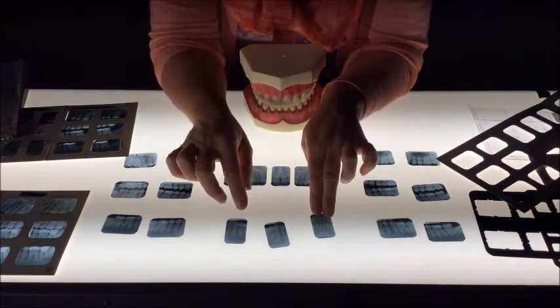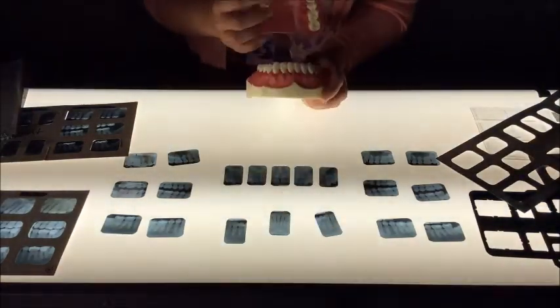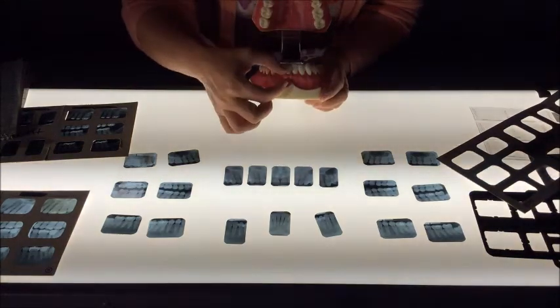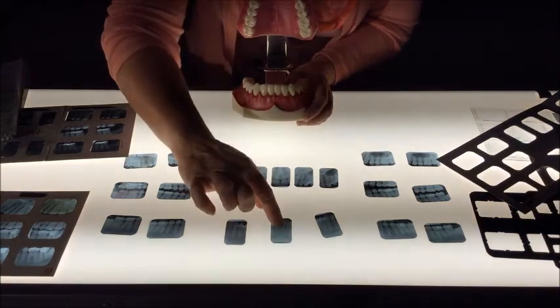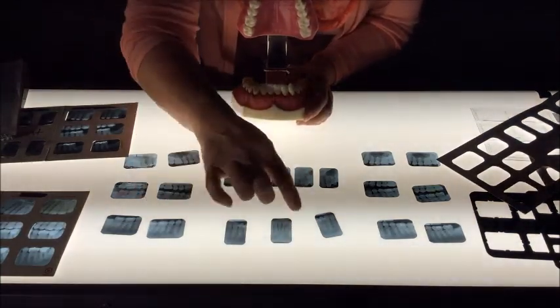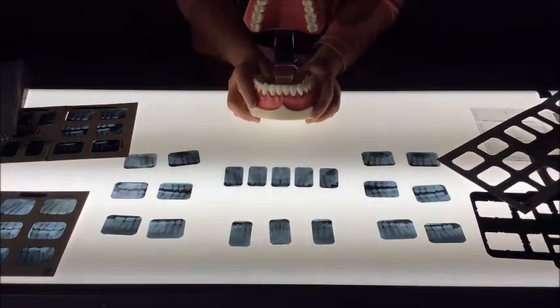We would do the same for the lower teeth. You want the centrals and laterals, which, generally on mandibular teeth, the roots appear smaller and the crowns will appear smaller. They will be pointed down to the bottom. And then you'd want the canines on either side, laterals and canines.